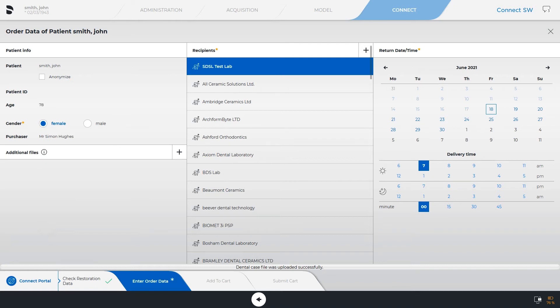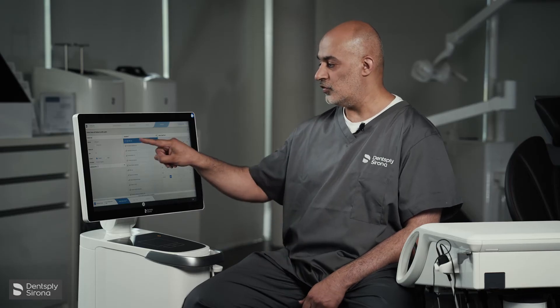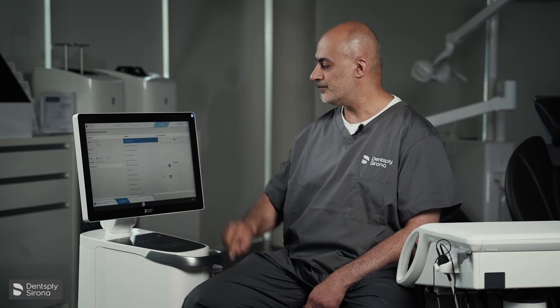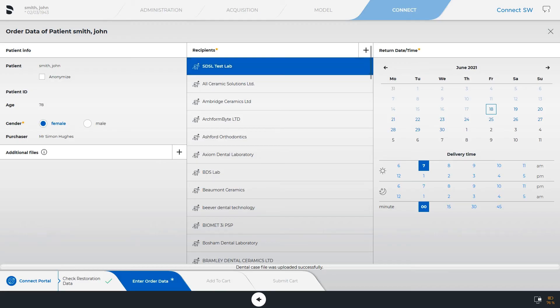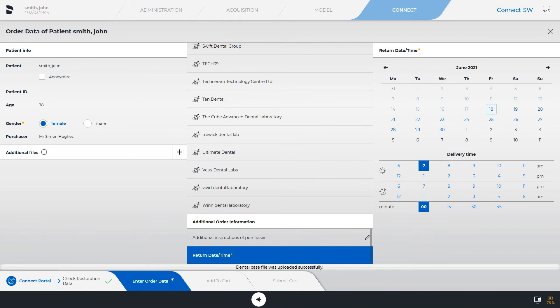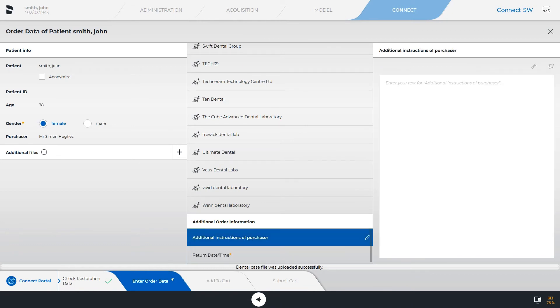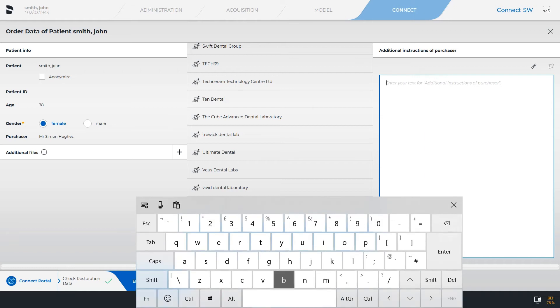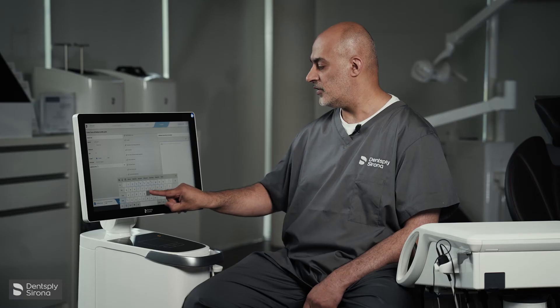Your recipient of the scan will be the lab of your choice. Whether it's an indirect lab, we're going to use the SDSL test lab. You then scroll down — you have additional order information, so here we will write bleaching trays, or whatever you're requesting, such as a set of printed models for example.